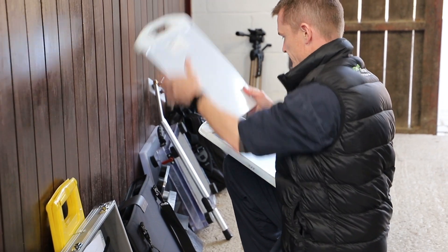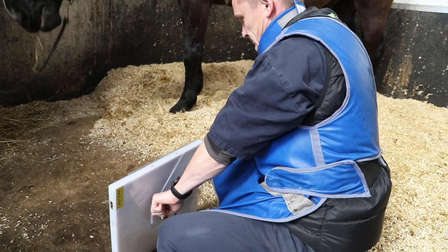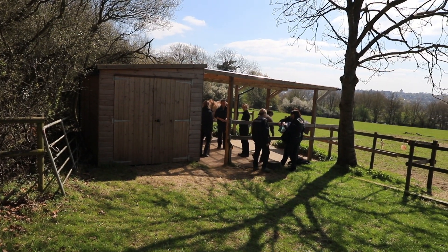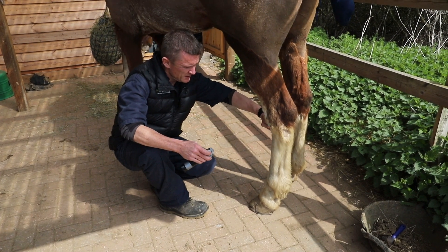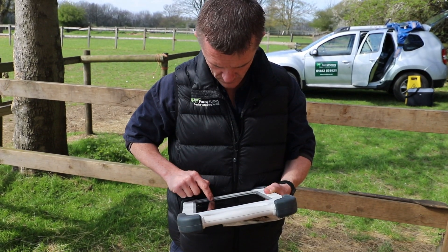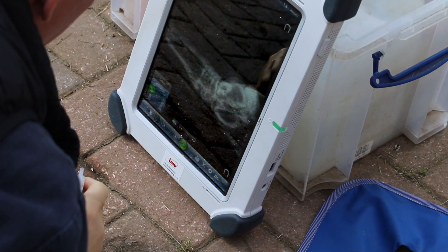The equipment is, to be honest, second to none. When we set up the practice we wanted portability and to provide the best clinical service possible. When you refer to big hospitals, yes they have all the fancy equipment — but with the way technology is moving, why can't we have that in the field? Now we can. To have a full X-ray kit in the middle of a field — we've done it where we've had fractures and you don't want to move the horse. Very few practices can come out to a field, not a plug-in site, take an image, and know whether that horse has a repairable fracture or not, then make the clinical decision. The patient benefits no end from that.